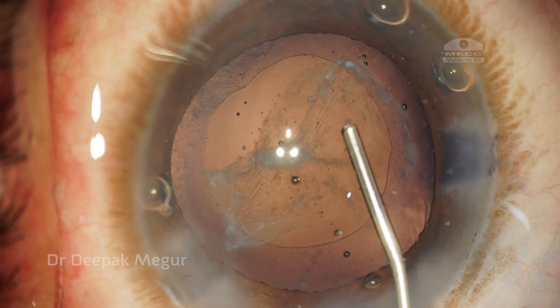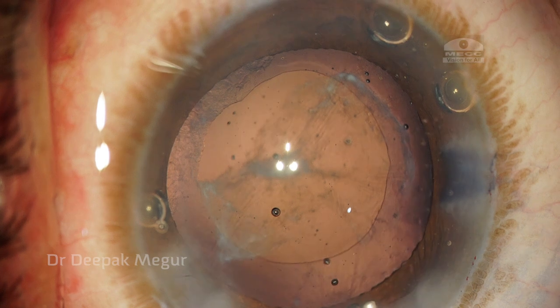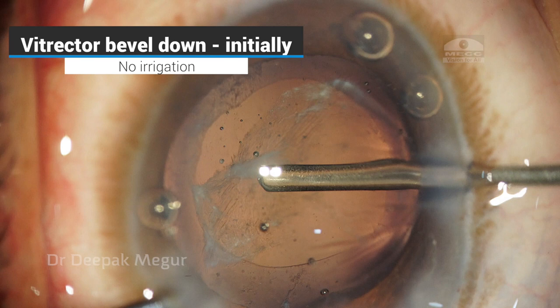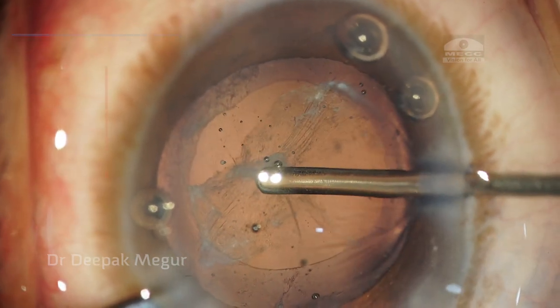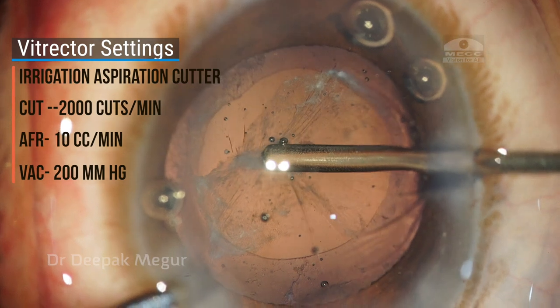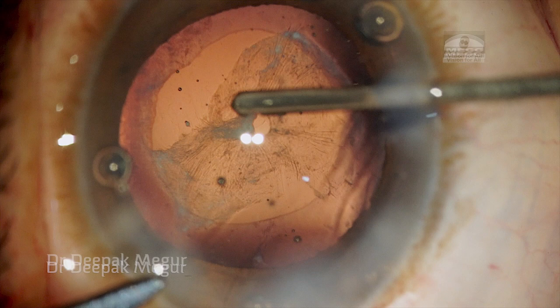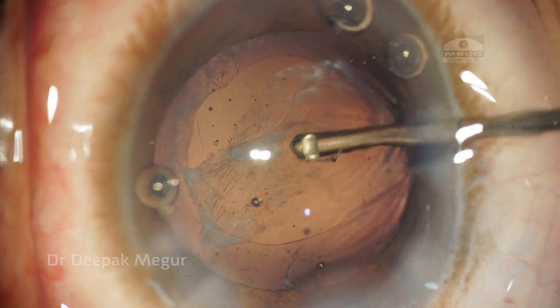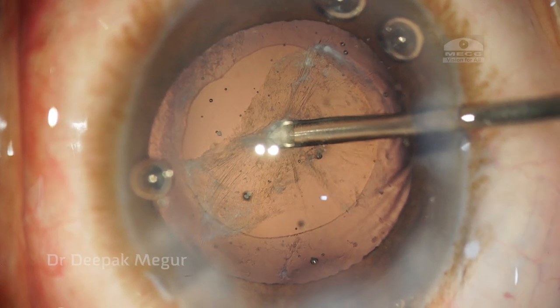I am putting in dispersive OVD — I am using Viscoat — just enough so as not to push the posterior capsule way back, making it easier to see. With the bevel down, without any irrigation, with settings of aspiration first and then cutting, I am engaging the posterior capsule. After a few cuts I get a cleavage plane, then I rotate my cutter bevel up and now I know what I am cutting. I can see what I am cutting and again start performing my capsulotomy using the vitrector.